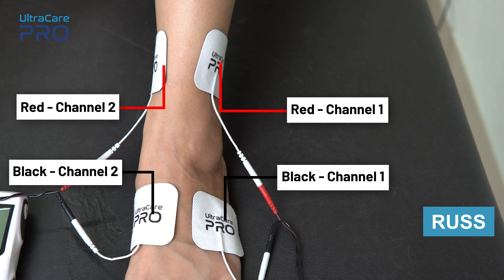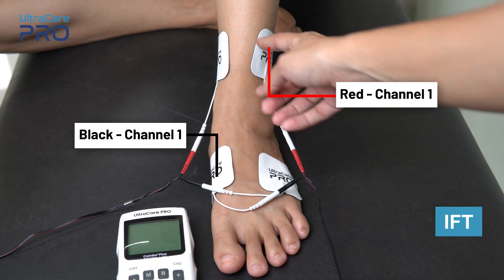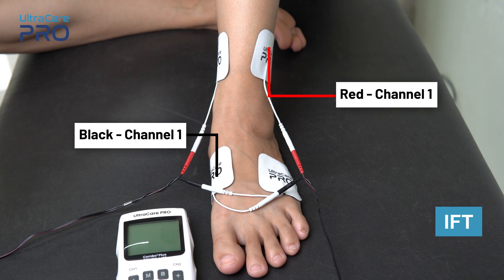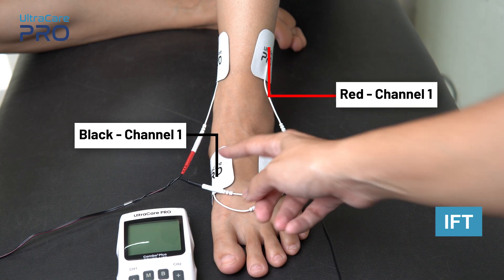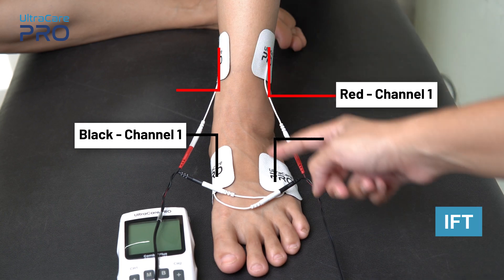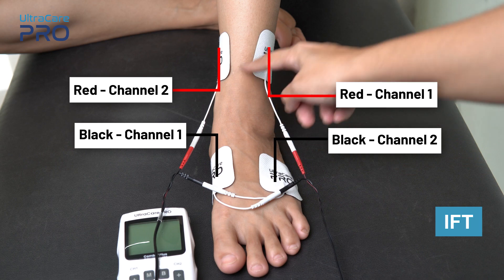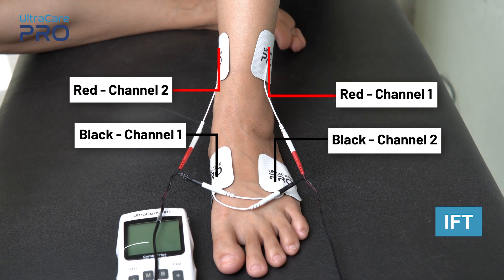For IFT application, place the red and black electrode from channel 1 on one side of the ankle in a way that they are diagonally opposite to each other. Similarly, place the red and black wire from channel 2 diagonally opposite to each other, so that a cross pattern is formed and the painful area is covered.